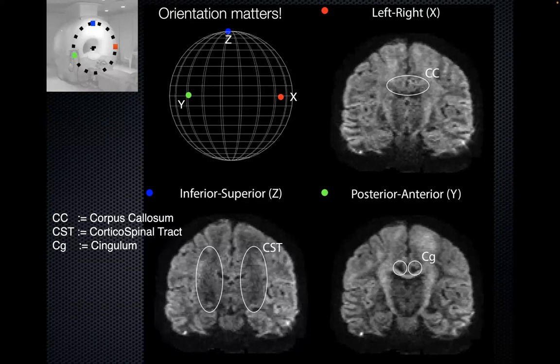That's as an image processor. So the radiologists are screwed here. They're like, what do we do with this? This is where the mathematics and the engineers or the computer science comes in and says, okay, let's put that into a rotation invariant model, right? If I want to reconstruct at each pixel the orientation of my structure, I need to put this in a model to get this orientation.